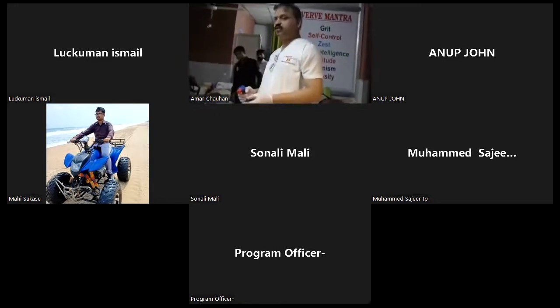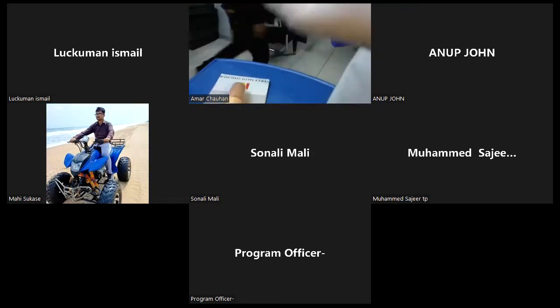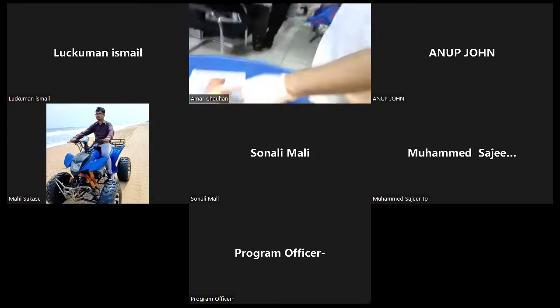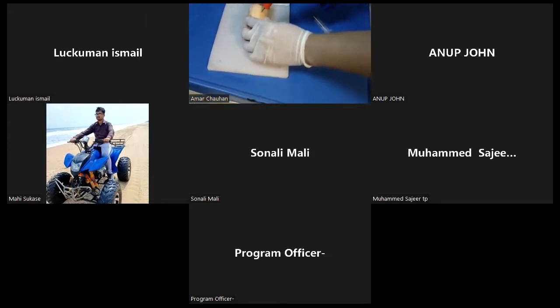So the next skill I'm going to demonstrate is IO access. This is our IO access trainer, this is our power driver, and this is our IO needle. Mount the needle over the power driver, and go perpendicularly 1 to 2 centimeters.